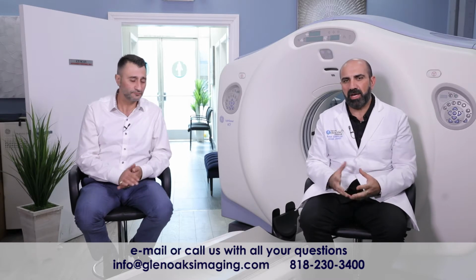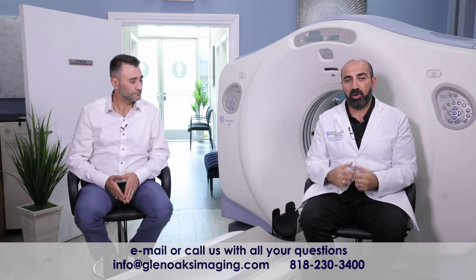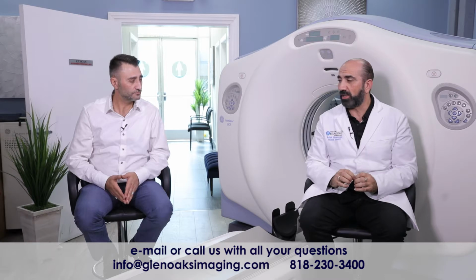Well, you can do MRI for every body part except where there is air or gas, being lungs, colon, and sinus. Those are pretty much the main ones that you cannot do with MRI. I mean, you can do it, but the image quality is not going to be right. There's nothing there to get a signal from. Exactly. There's air and no water there. Like we said, we get the image from the patient's body water. The lung doesn't have water. Colon doesn't have water, and sinuses don't have water.